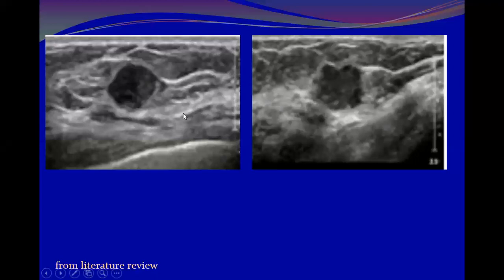You will not grade it the same. If I tell you this is the same lesion, what does it mean? I'll put it on the angle, right? If I tell you this lesion is the same as this lesion, yes, a difference in the angle, I think. What does it mean, the difference in the angle? It means I took the probe perpendicular, and then took it at another angle. Okay, so you mean the scanning technique of the lesions.